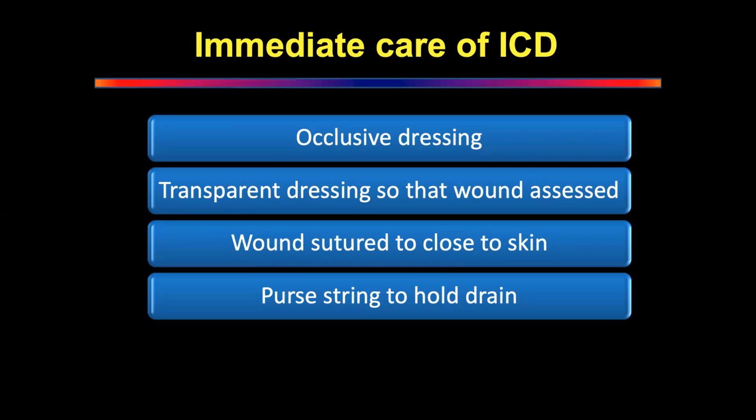Placement and marking. Marking of the drains, the placement, positioning. What do you mean by marking of the drains? One is an identifier, one is apical, one is anterior. You have to label it separately and identify which is apical and which is basal on the operating table. And it should be done by the surgeon who's putting in the drain.